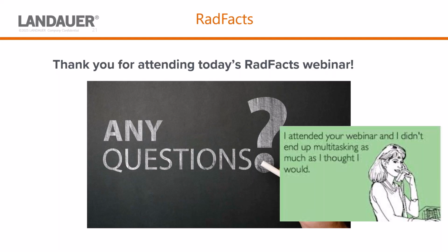You type in this serial number, so only the person wearing the dosimeter has access. It'll give you the information for that participant. It's a very nice way for them to have access, and the state approves as long as they know the process. But yes, the participant should be made aware of their exposure levels.